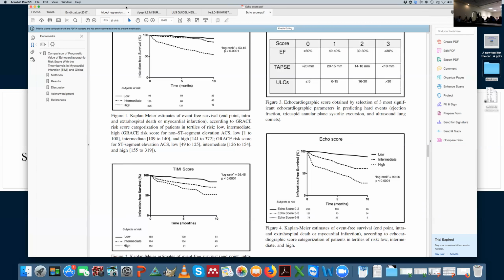And it was very exciting to see how the B lines appeared at the same time the patient mentions the chest pain. Okay, and maybe the patient doesn't show low oxygen saturation or even struggling to breathe. And we saw on that occasion the immediate appearance of B lines in his lung. And it was very demonstrative how the B lines can appear without any symptoms from the patients, in a preclinical setting or a preclinical scenario. Probably this patient was the one Luna was speaking about.